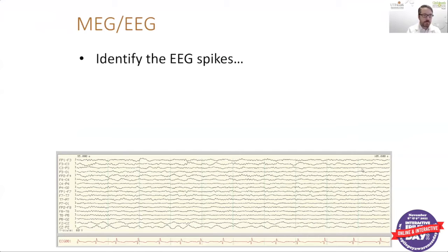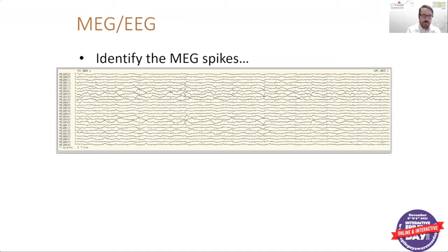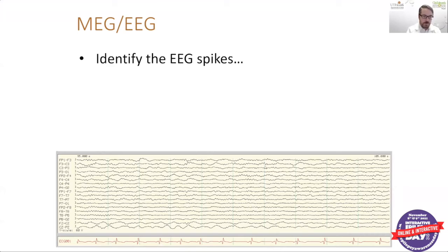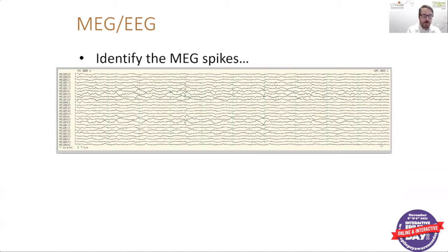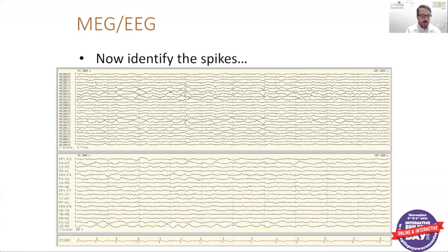Here is an example of how we read MEG. On our screen, this is the EEG section where we look for spikes. Here's an example of the MEG portion of our screen, where we're also looking for spikes. The spikes are not quite as clear on the EEG; however, on the MEG you can pick up a pretty clear spike. When you put the two together, they are time-locked — looking at the same time point — with all EEG channels and a section of the MEG sensors, which we can change to get different views.